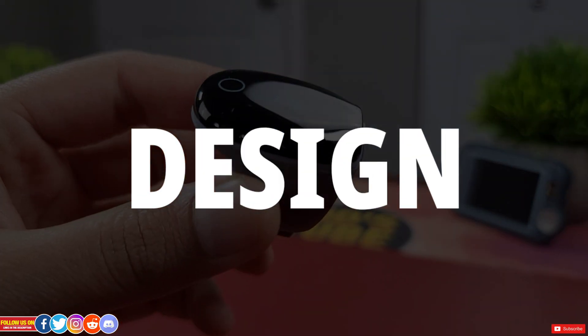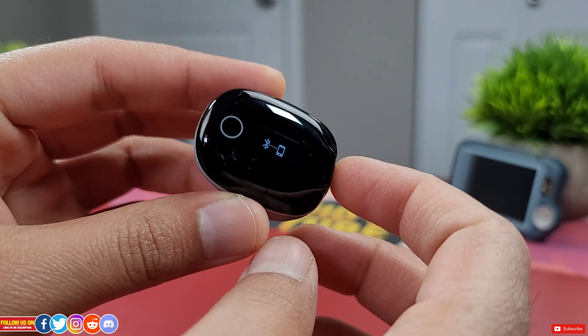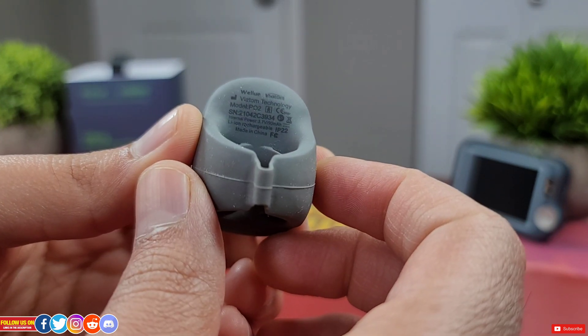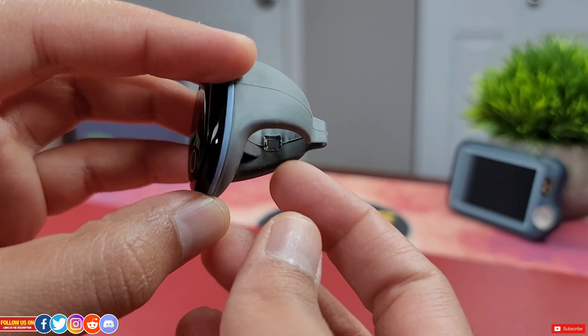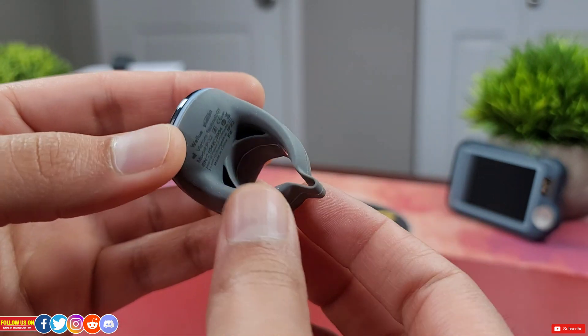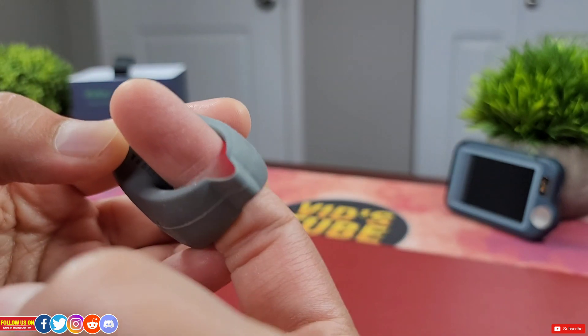In terms of design, the ring itself is very tiny with a display on top encased in the ring. At the back there are a few details. The two sensors are located on the sides — one is a light emitting diode and the other sensor that absorbs the light is on the other side. The ring is quite flexible and would easily fit any finger, as a flap at the bottom helps to achieve that.